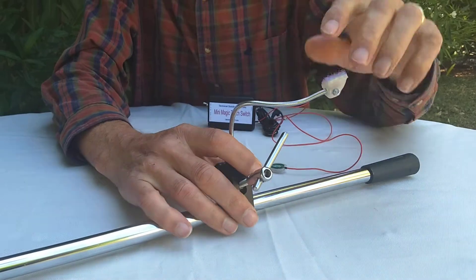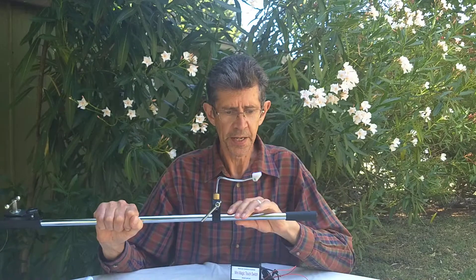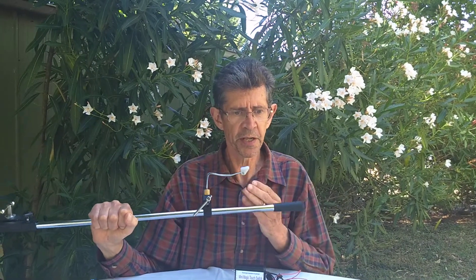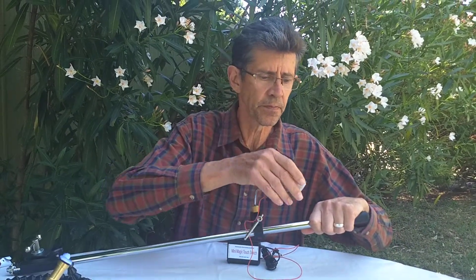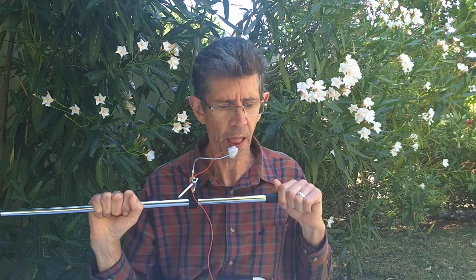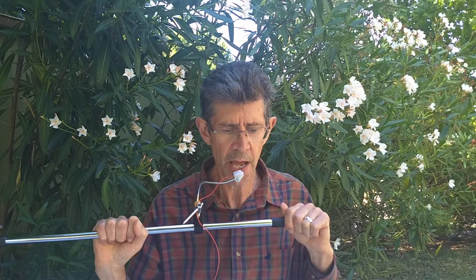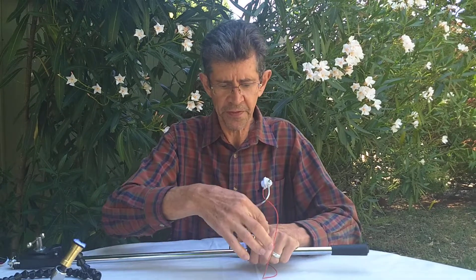A good example of where this might be useful: imagine someone driving a wheelchair with a chin control, a chin joystick. We can mount that beside it with the little sensor velcroed on the top. You can drive the wheelchair and reach over and activate the touch switch quite easily, and it's very flexible and so light and small it doesn't take up much space in front of the person's face.